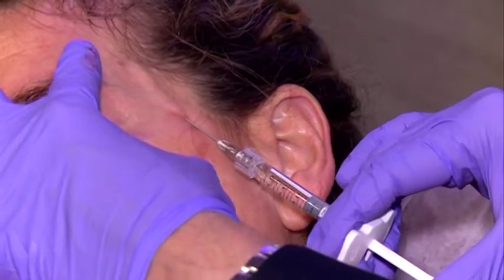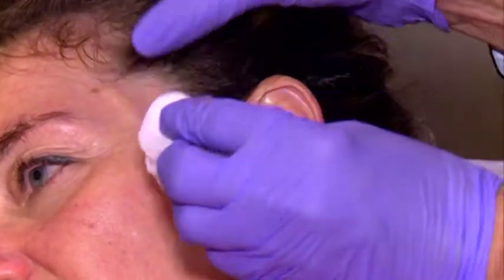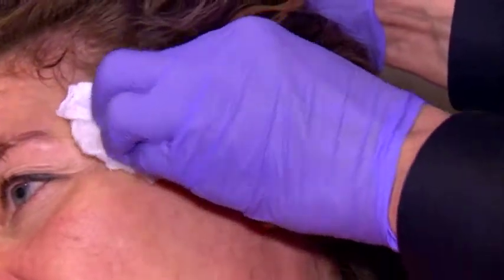And you see, I demonstrate this once more. You see this line here? That's why I'm superficial. I'm above the fascia. And now I massage it. 1, 2, 3. It's gone.